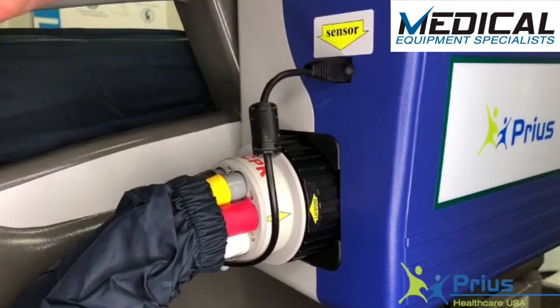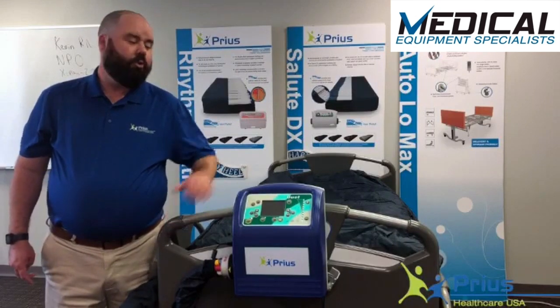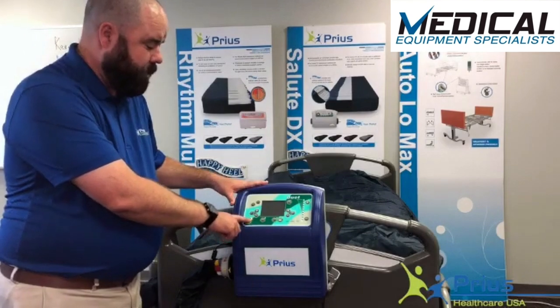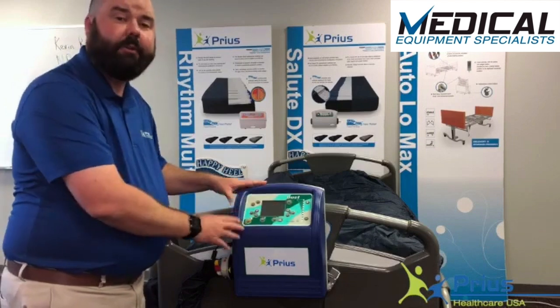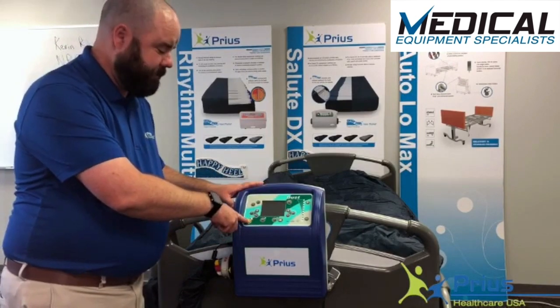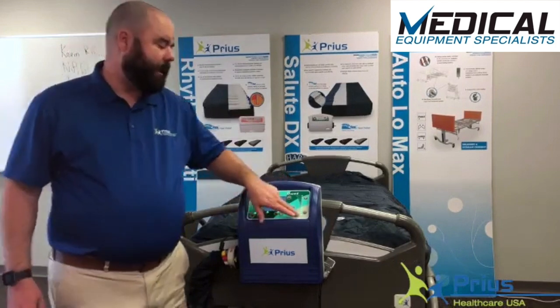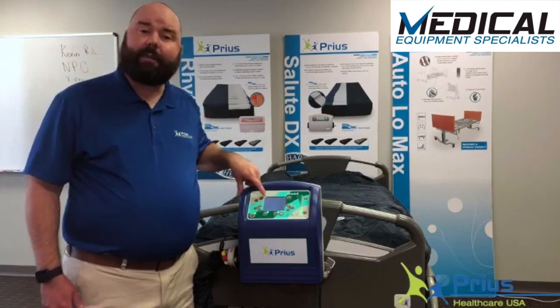That sensor is used for the auto-fowler feature that we'll discuss later. Now that the mattress has been connected to the control unit, we can go ahead and turn on the Duet mattress system. There's a power button on the center control. With the mattress plugged in, there's an orange light that'll illuminate to let you know the control panel is ready. Push and hold the power button for about three seconds and the system turns on. When the control panel turns on, the mattress immediately defaults to a comfort setting of four and the static mode for therapy.